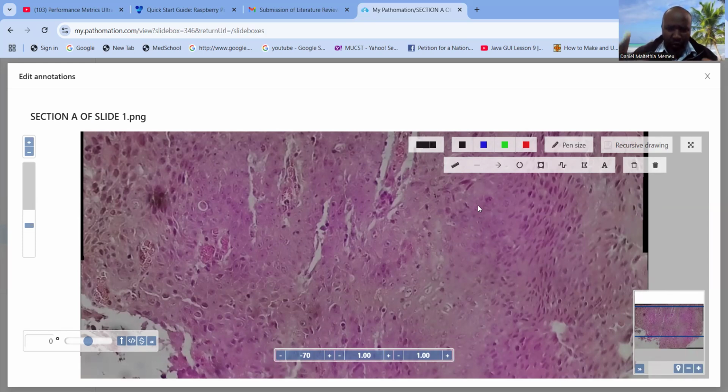So the thing is, you are supposed to do two things. After you examine the image, you are supposed to determine whether the image contains some malignant areas, or if not malignant. So you are supposed to label the image as either malignant or benign.